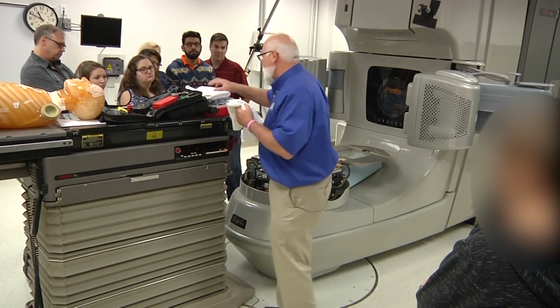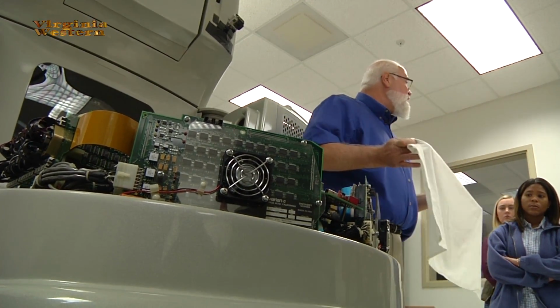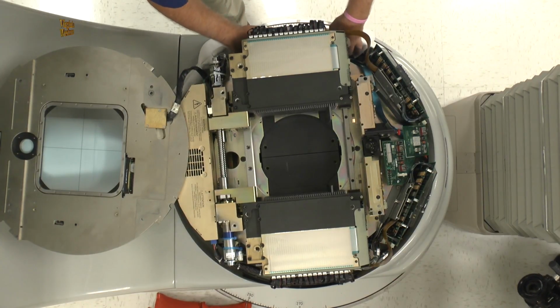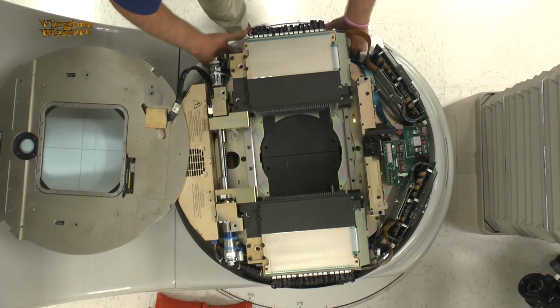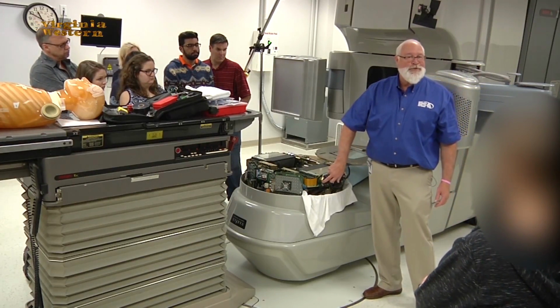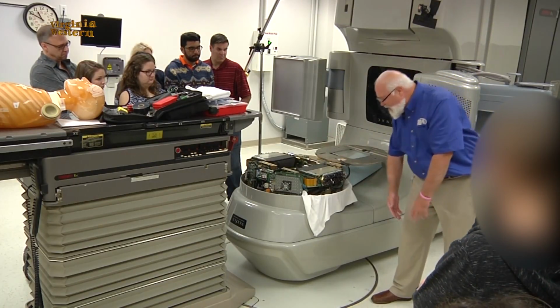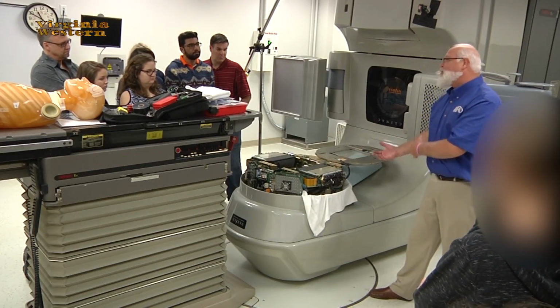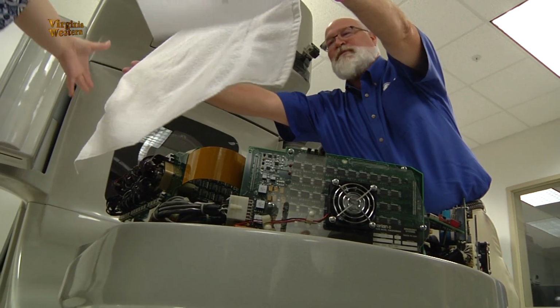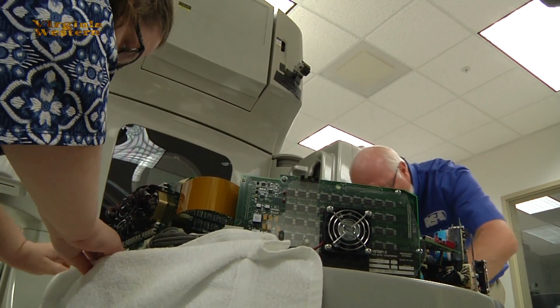Another safety precaution I use, and it would probably be a good habit for you to get into: if you're going to do any service on the MLC, like changing a motor, always put a towel in here. It's not so I don't get anything dirty. It's to catch the screw when you unscrew it and drop it. Because inevitably when you drop it, it's going to fall down to the side and right down in here, and then you have to pull off the top cover. So that's why I put the towel in there. Let someone grab a towel and stick it on that side, and you just want to tuck it over the lead and into the lead so it holds.